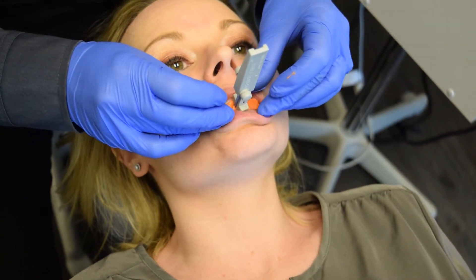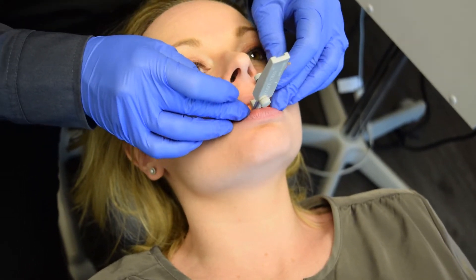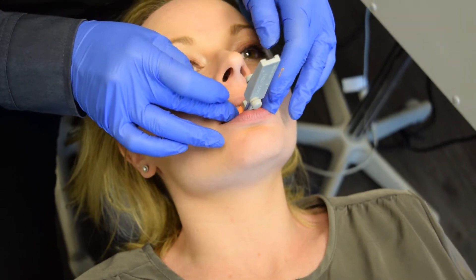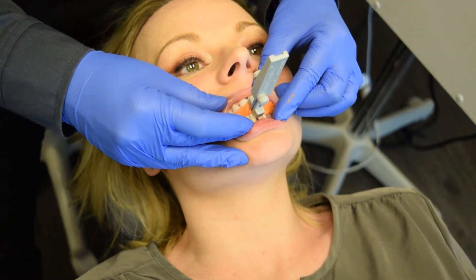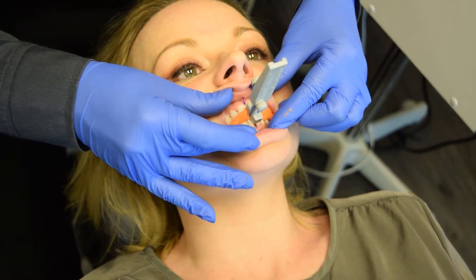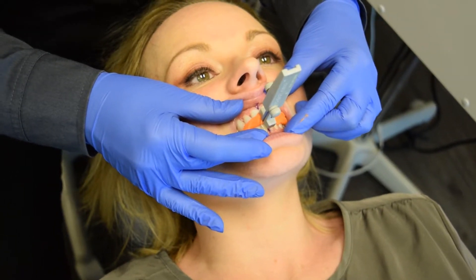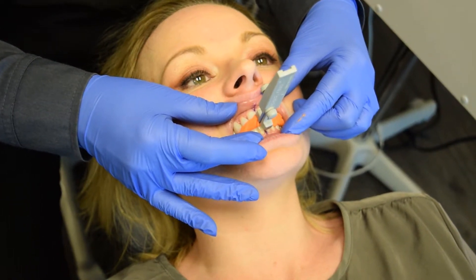You can see there the bite that you recorded. Please don't use too much — you don't want to be locking this in. The nice thing about the luxabite, as well as the obite, is it's very rigid, which is good, because you want a stable bite to mount your cast or to your digital bite. You can trim it with a blade or with a burr — it's that rigid — so you know you've got stability in whatever bite you're trying to capture.